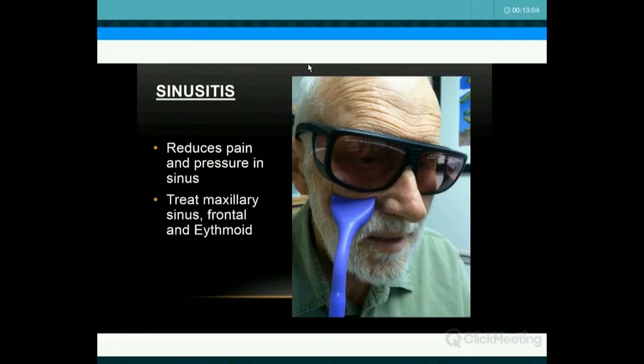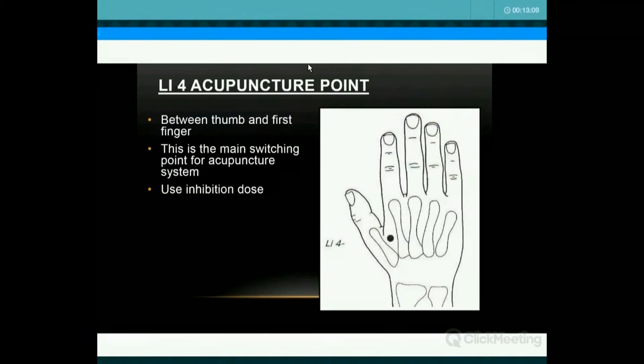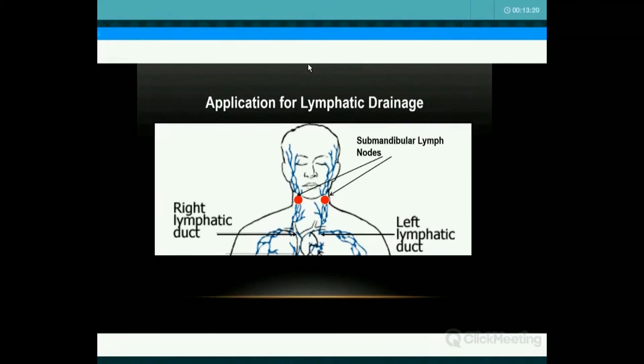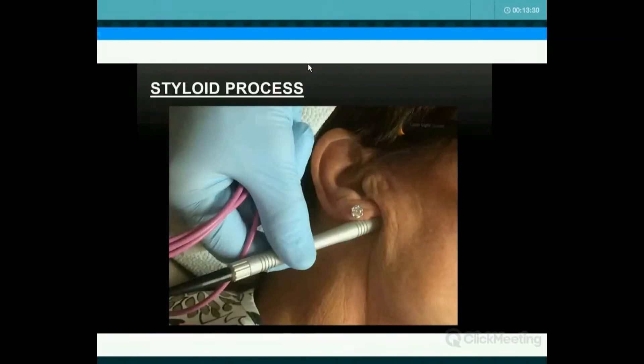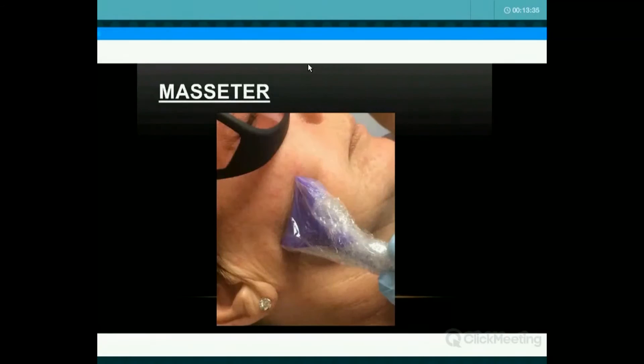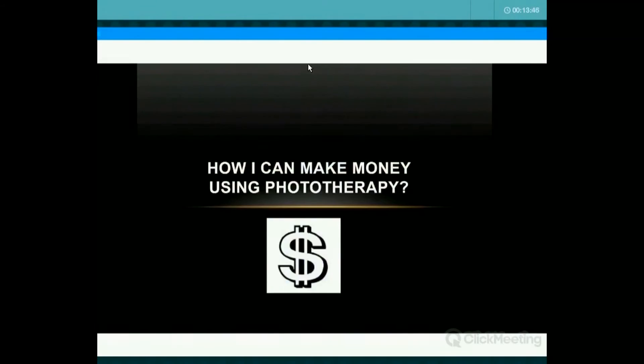For sinusitis, it's very effective — just treat the sinuses and also treat the lymphatic system. For TMJ, it's also very effective. First I treat the LI4 bilaterally — that's between the thumb and the first finger — using inhibition dose. Then I treat the lymphatic system, always at the stimulation dose. Then we treat the different muscle areas: the TMJ joint itself, the styloid where the joint capsule is — this is very sensitive in a lot of patients — and the masseter along the zygomatic arch to the angle of the jaw. Then temporalis, along the muscle wherever you find it's sore.